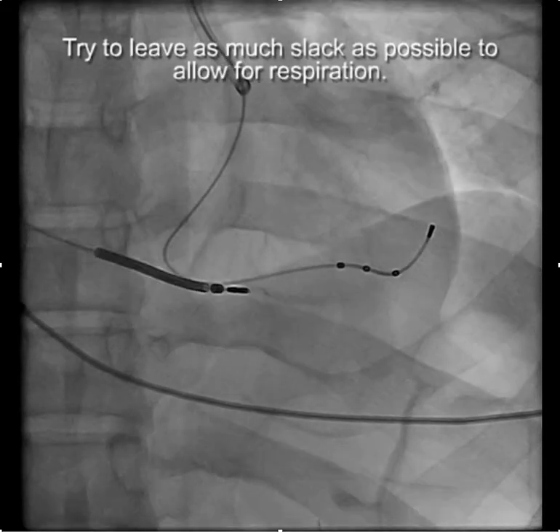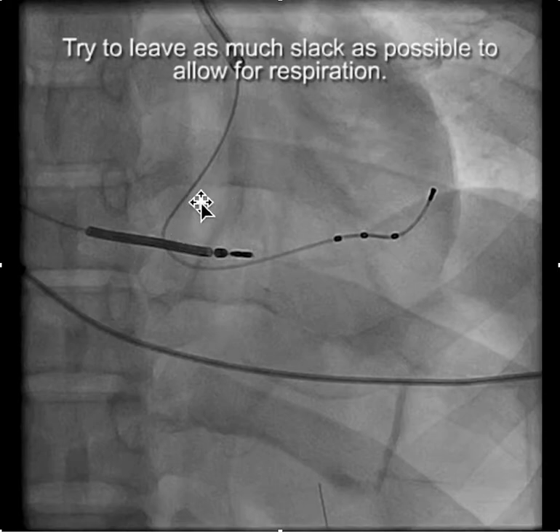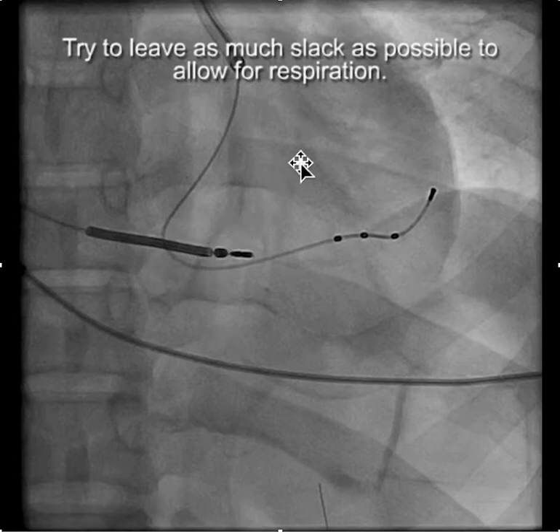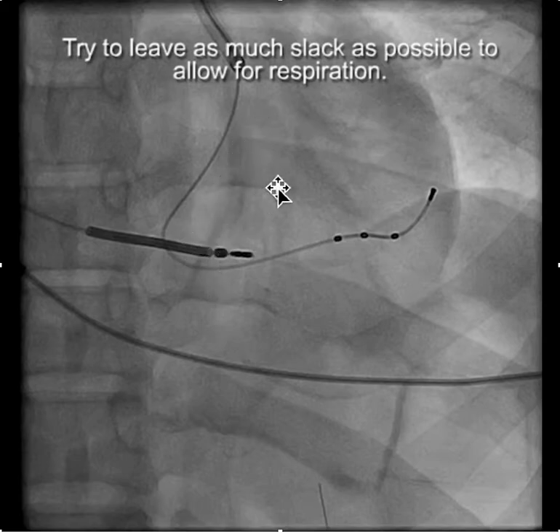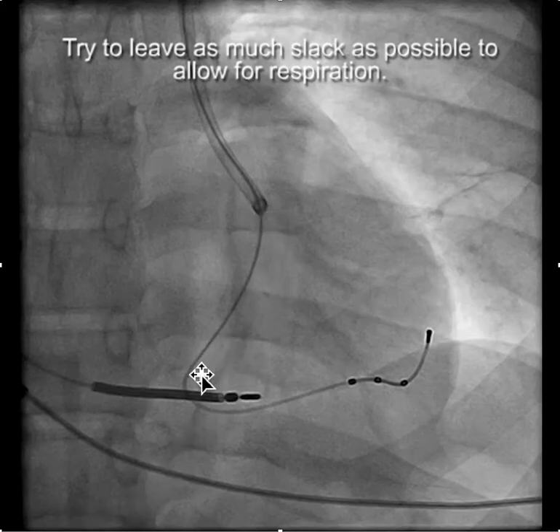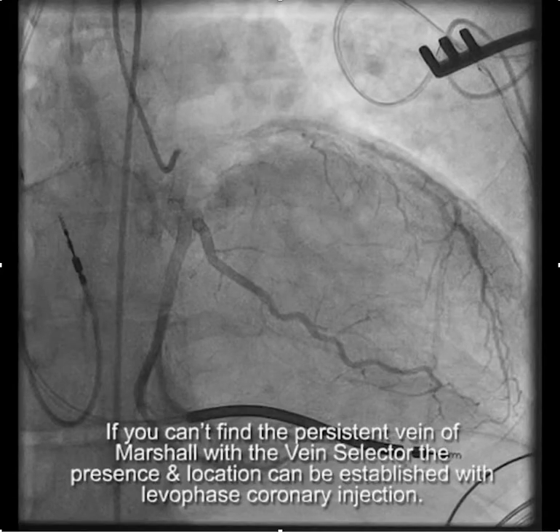Because the patent vein of Marshall enters the coronary sinus at its midsection, implanting can be tricky because half of the targets can be above where the patent vein of Marshall enters the coronary sinus. However, you really don't have any option. So when you're finished, you want to make sure that you put as much slack as possible into the lead to allow for respiratory variation.